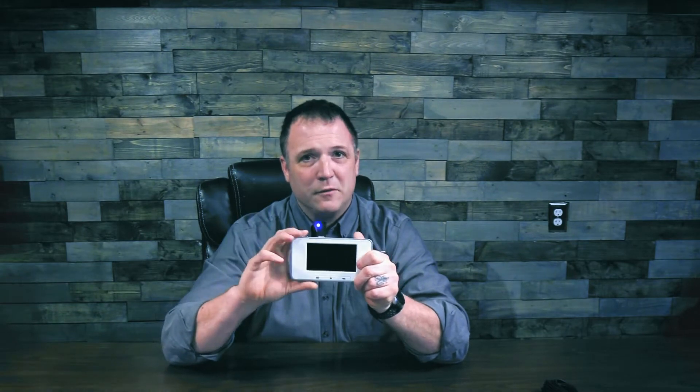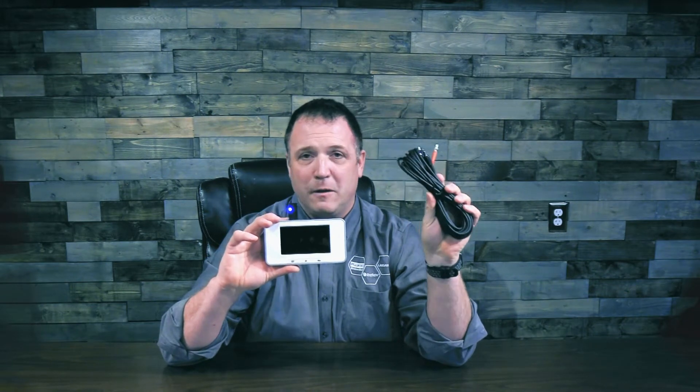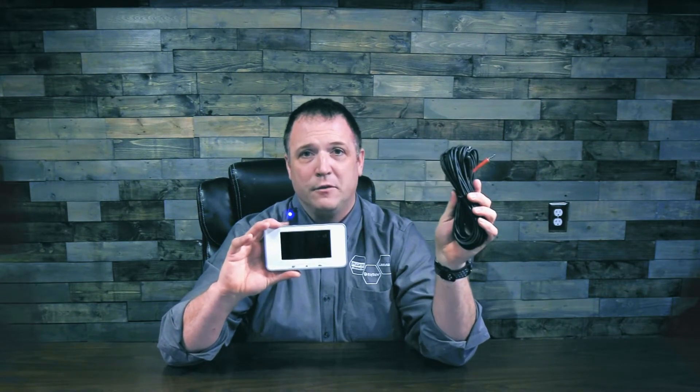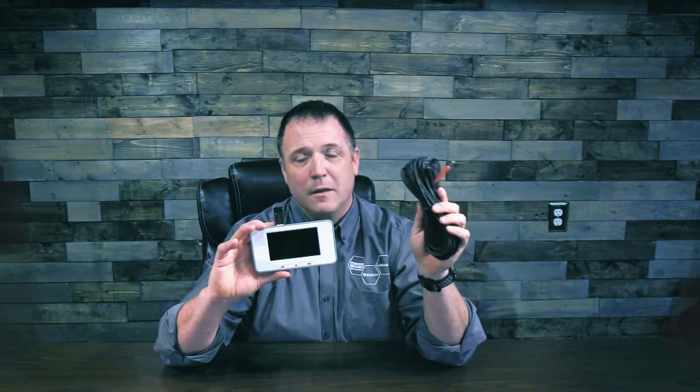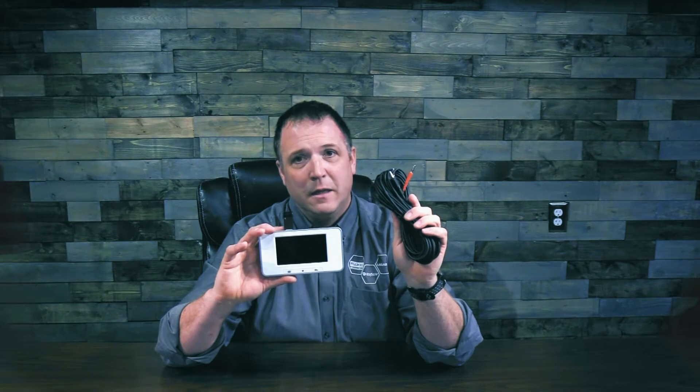But before I can show you the new product, we need to talk about mAs, or milliamp seconds. Those familiar with the RaySafe X2 know that we usually measure mAs with our mAs cable connected to the base unit and into the test points in our x-ray machine to generate an amperage and time reading. But some manufacturers actually need machines required to take a voltage reading and time.